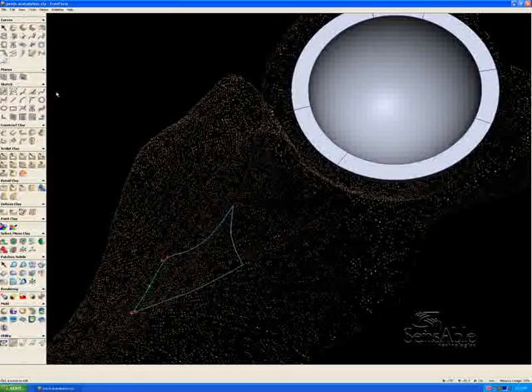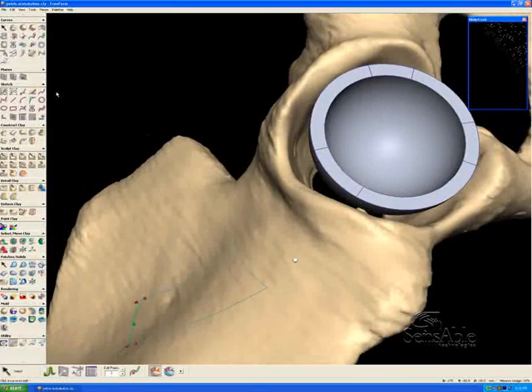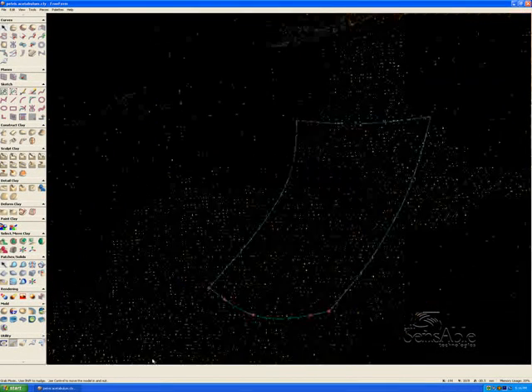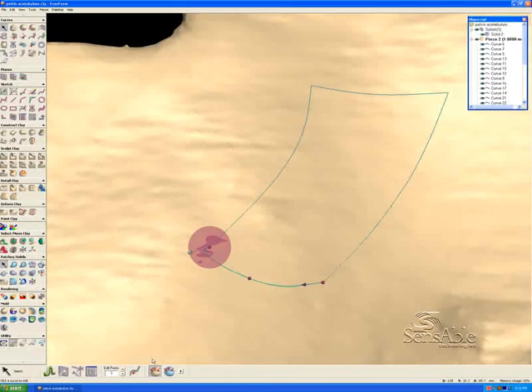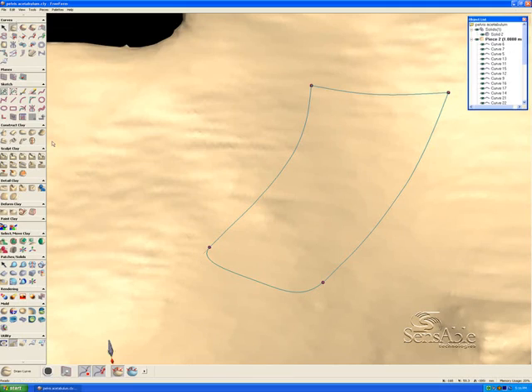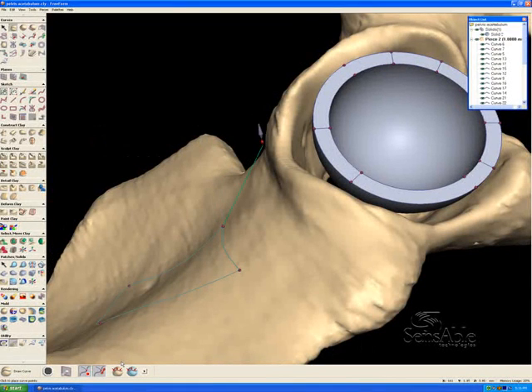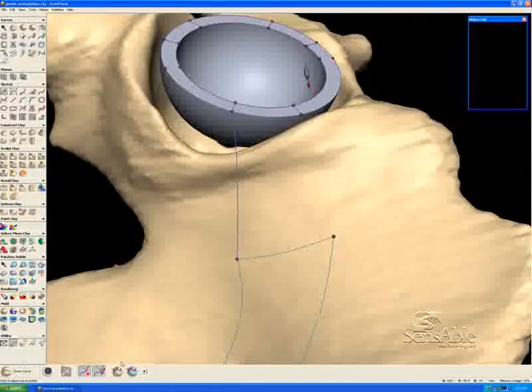And we're almost done with laying out the geometry of this tab. The next step is to go into our curve drawing tool. Again, I seem to have broken that, so let me just refix that for a second. There we go. And I'll go into the curve drawing tool again, and I'm going to turn off Snap to Clay because I want these curves to be free floating in space. And I'm going to make 3 clicks here. 1 at the beginning, 1 at the end, and 1 in the middle.